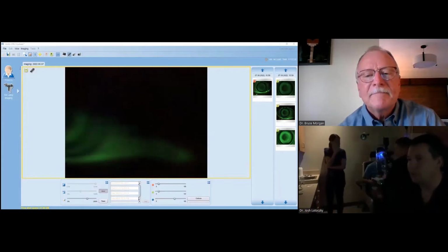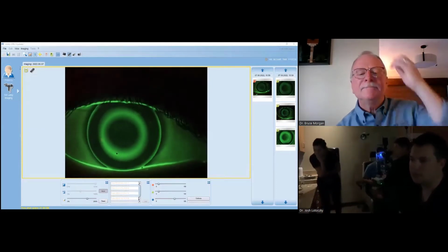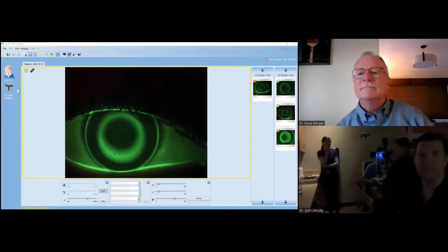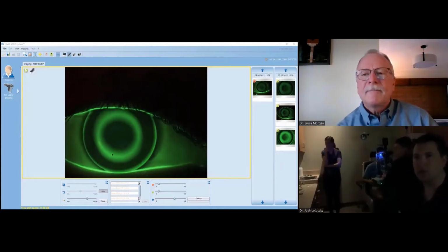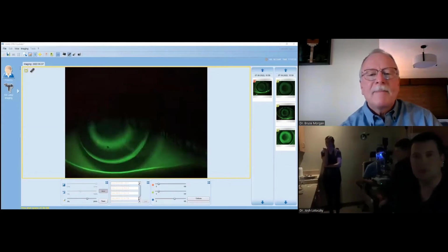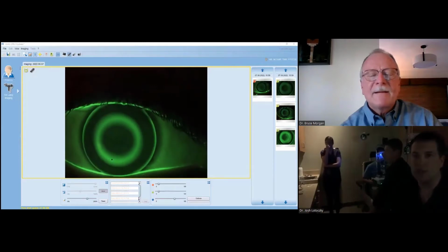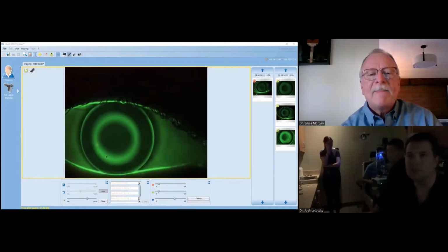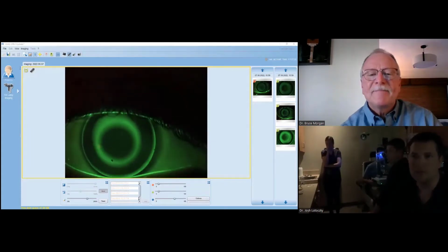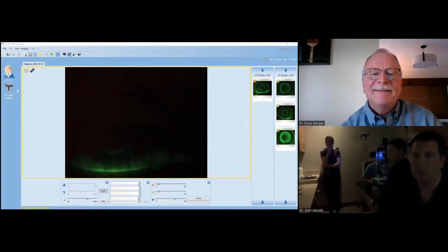I would say one of the most common mistakes that we oftentimes see people make is making changes immediately. They'll try to go for perfection on that very first one. And you've seen a lot of lenses in your day. How many of them have you seen that are not necessarily that textbook appearance on day one, or on dispense, but after they've worn that lens, whether it's day one or even a week, they come back and you're going, wow, that's doing exactly what we want it to do? Yeah, a lot. Seen that a lot.